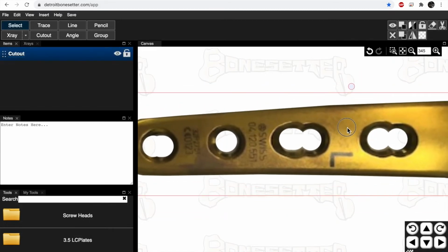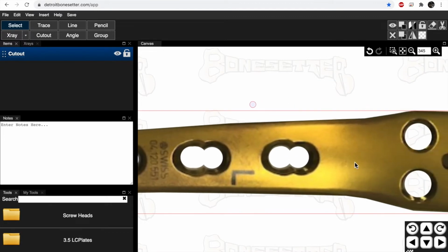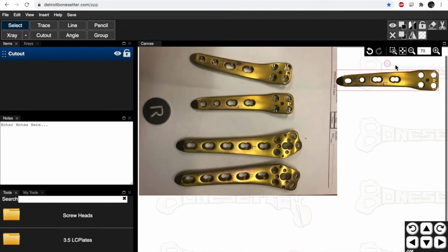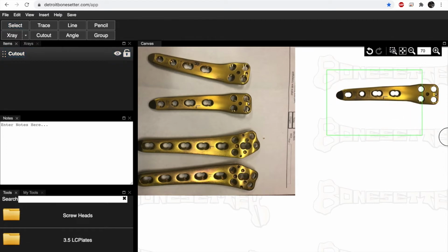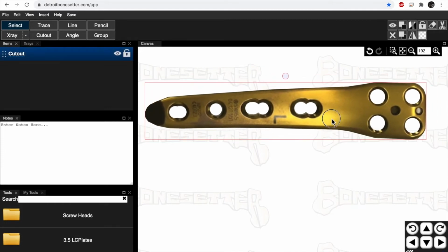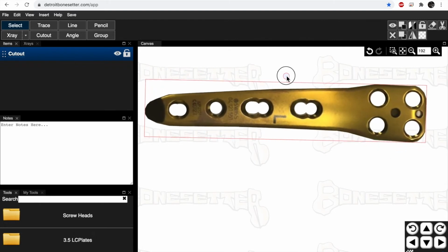So now I've got my cutout, and you can see I can see right through it. So I've made this a see-through tool, and I'm going to go to the regular. So let's move this over a little bit. I'm going to center this. I'm going to look at it again. So there it is. There's my tool that I've made. I can turn it, and now I'm going to save it as a tool.